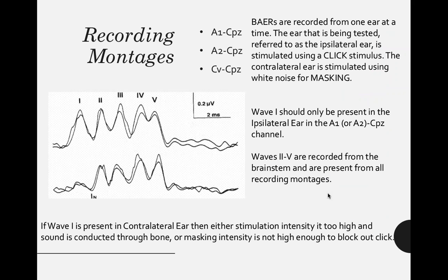Okay, our recording montages. Here it's going to get a little complicated, especially in relation to our SSEPs, but the thinking is exactly the same.